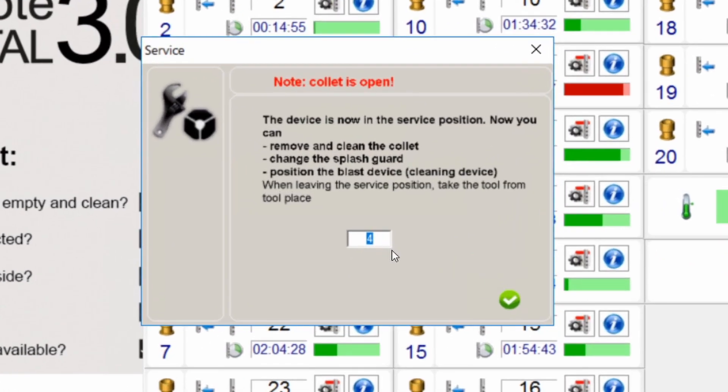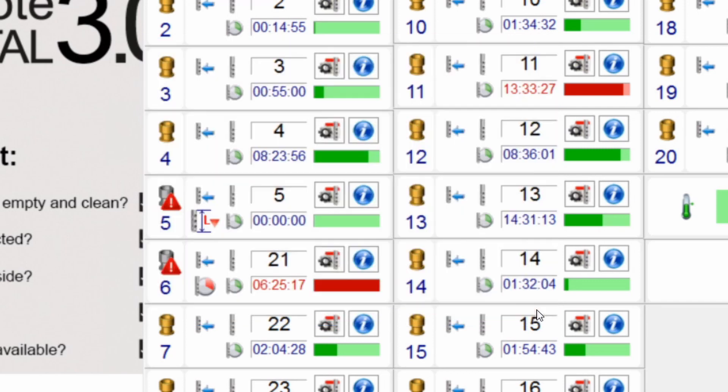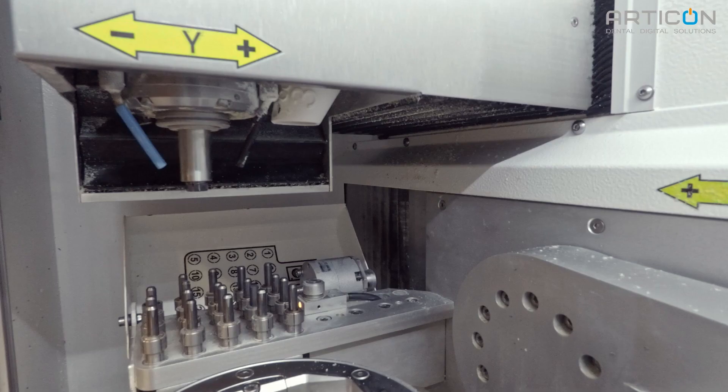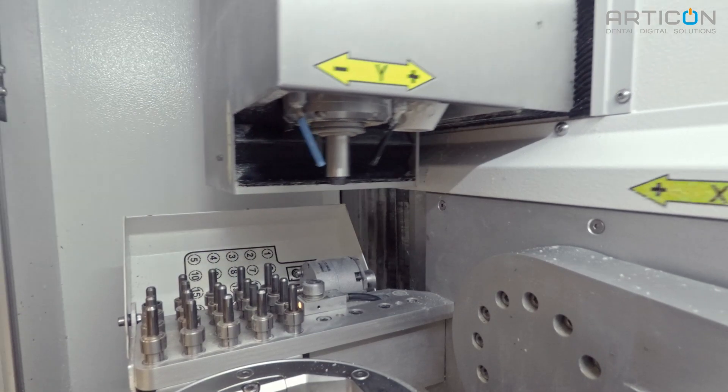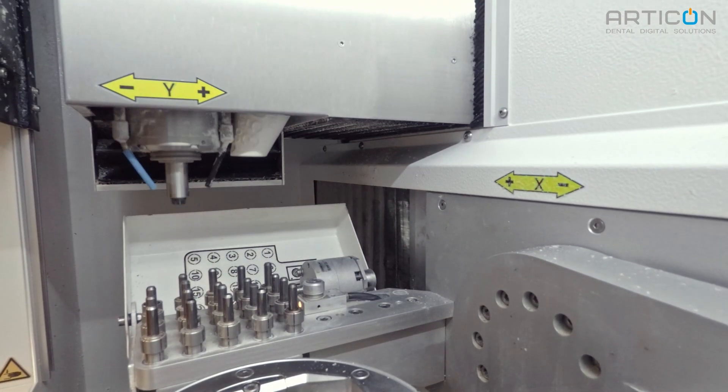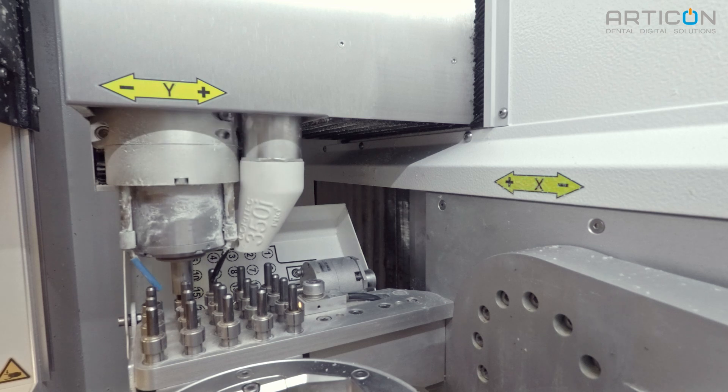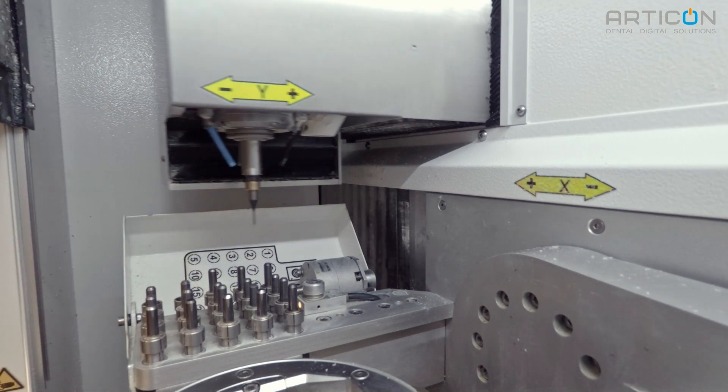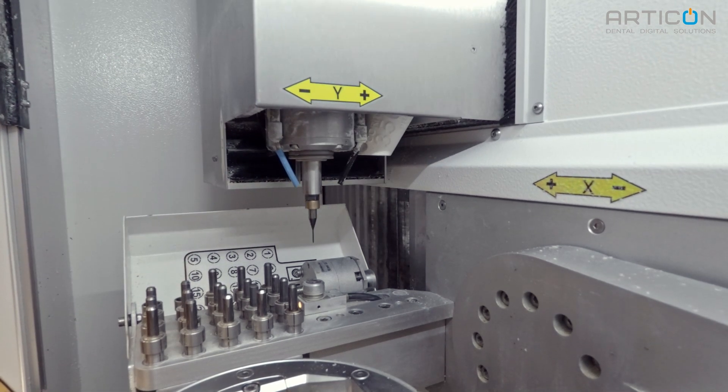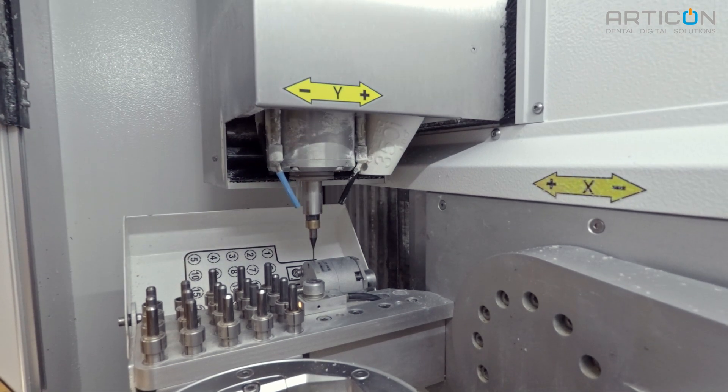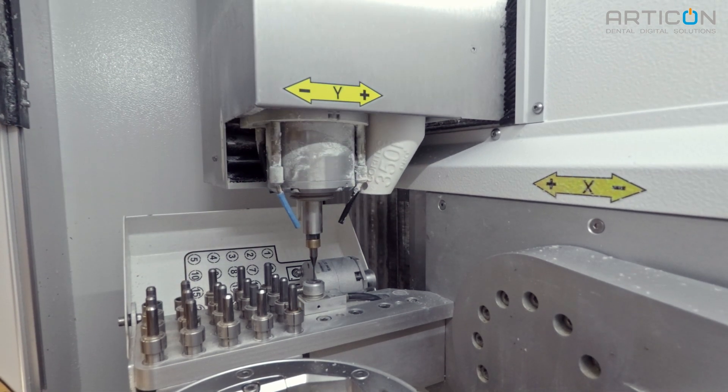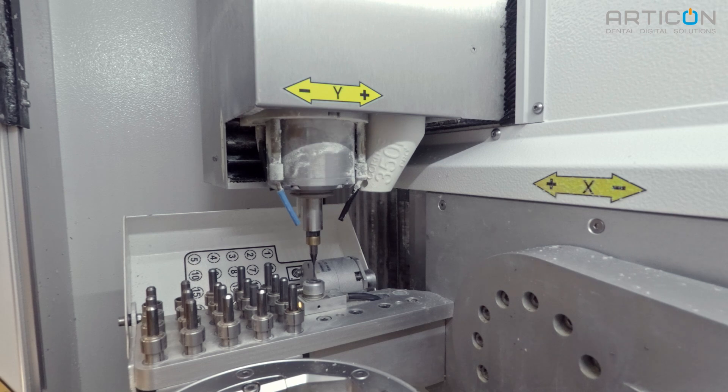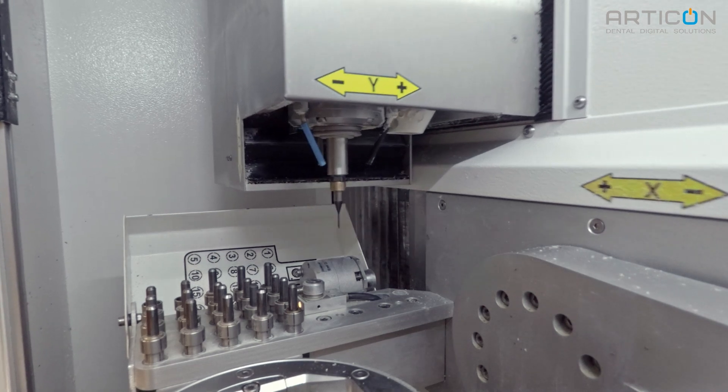As default, the window shows the previously used tool number. We can leave it as is or change the tool number if we want to. After the tool number is confirmed, the machine picks up the tool and measures it. Now the machine is ready for operation.